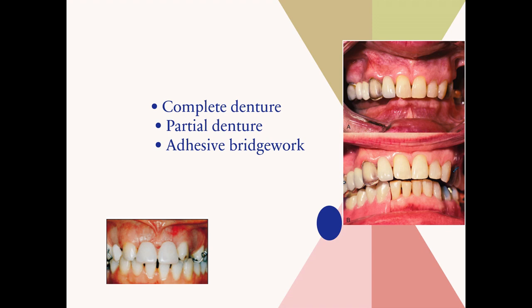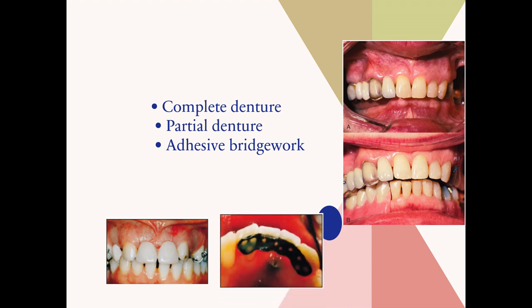Especially in the replacement of single teeth or small spans in anterior regions. So here is a Rochette bridge that is used as a provisional restoration. You can see the head of the implant below the mucosa. Finally, fixed bridge work can also be used, particularly for patients having extensive treatment who are not prepared to undergo a period of time without a fixed restoration. So these bridges will have to be modified following abutment connection. So these are the different types of the treatment processes or the provisional restorations.